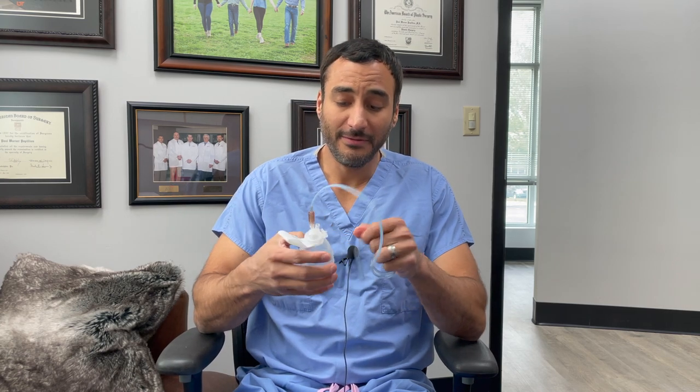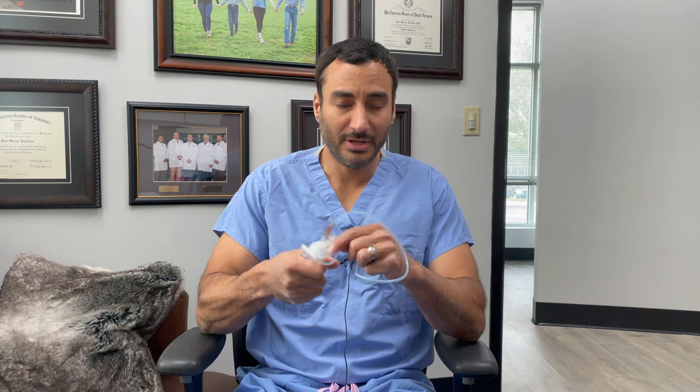Troubleshooting: if the drainage stops immediately — in other words, the drain has been putting out 20 cc's or 30 cc's every day or so, and it just stops and nothing's coming out — the odds are it's clogged. When it gets clogged, a lot of time you'll have a little bit of fibrinous tissue, which is kind of like healing tissue on the inside. That'll plug up the tube. When that occurs, you need to strip the tube.